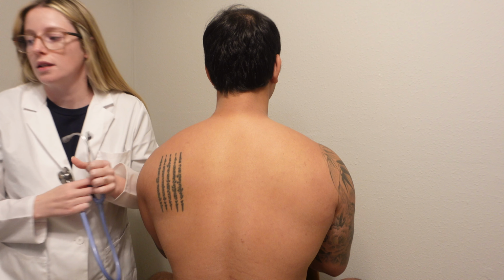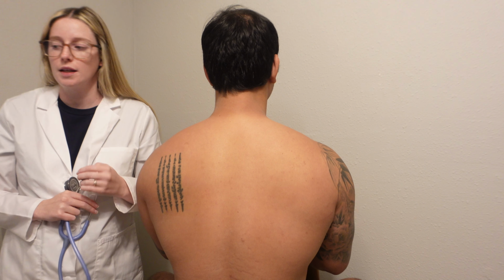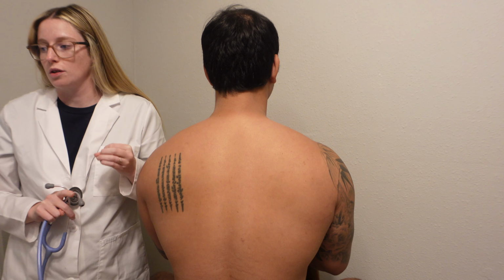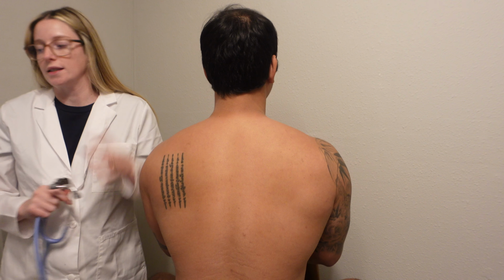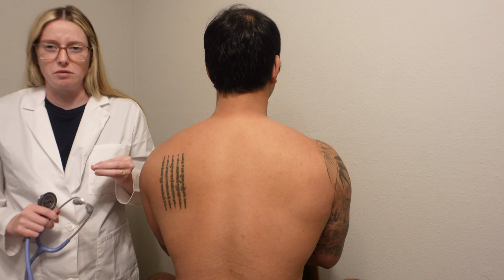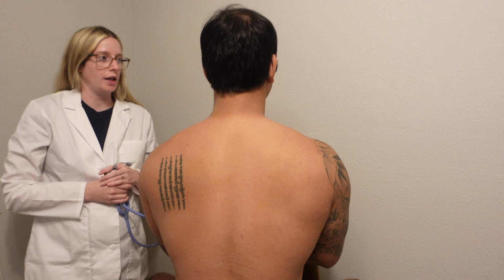And when I'm listening to the lung sounds, I'm making sure that they are clear and equal on both sides. Stuff that you could hear is like crackles, which is a core sound, wheezing, which is really common in asthma or bronchitis as the air is getting constricted and can't get out. Rhonchi means really coarse and rough sounds, kind of wet. But his lungs were clear and even on both sides.